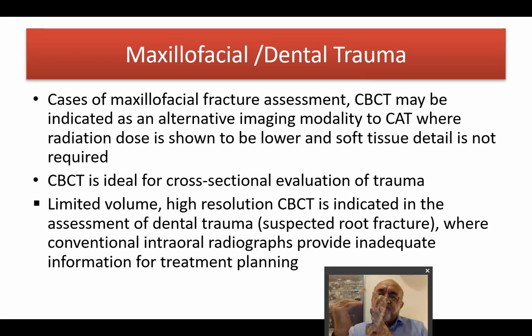Always try to view the tooth with at least two radiographs, either with a tube shift technique, horizontal tube shift technique, vertical tube shift technique, so that you would see the missing dimension. So two-dimensional radiographs fail to show the depth, and thus the fracture line might be hidden.